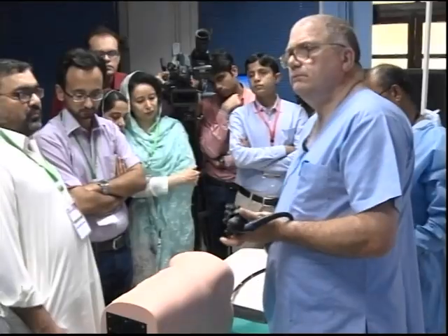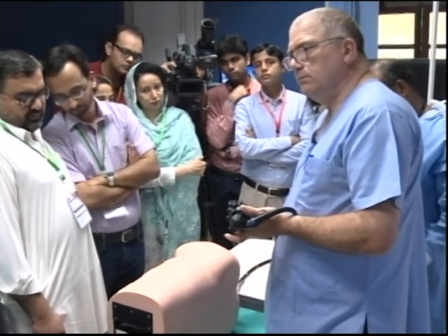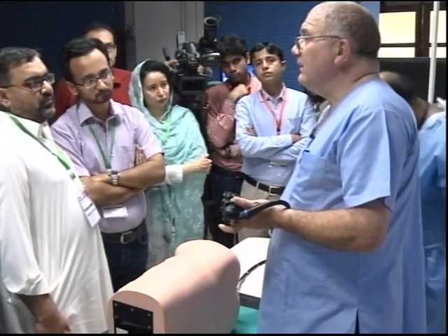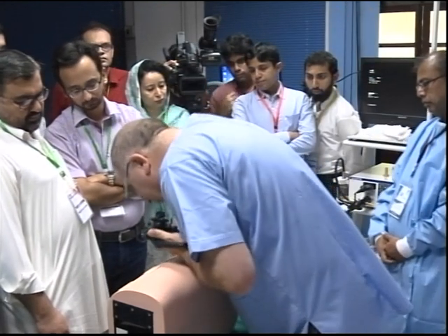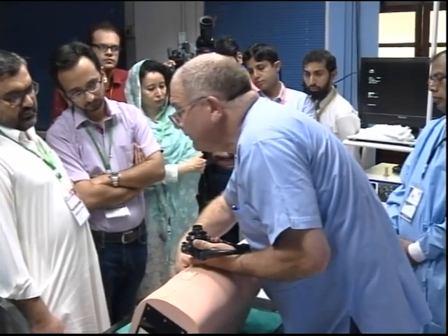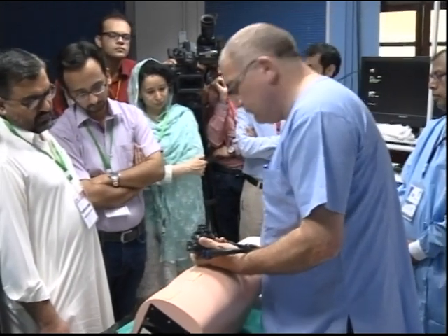What part of the bowel? Excellent. So, where am I at the moment with the scope? Rectum. And is the rectum dilated up enough to go through? No, not really. So I want more air. Would that be correct?